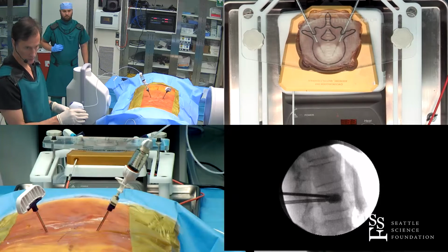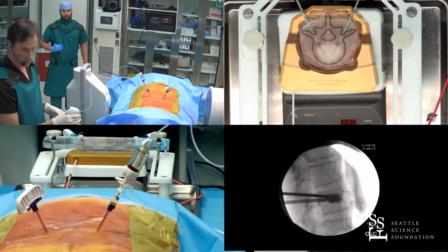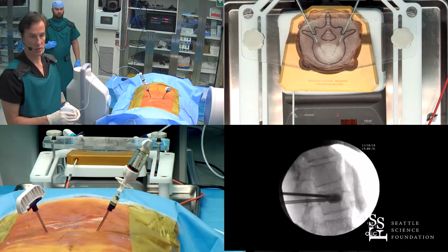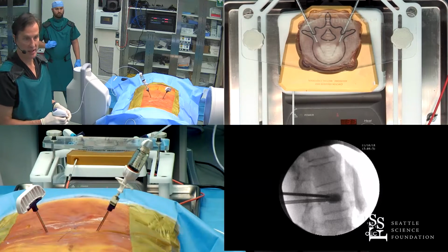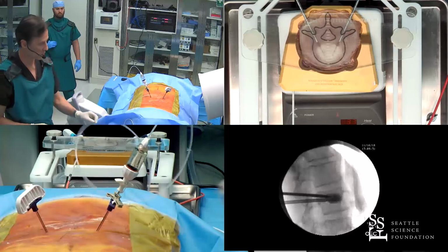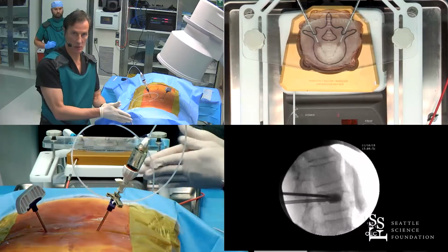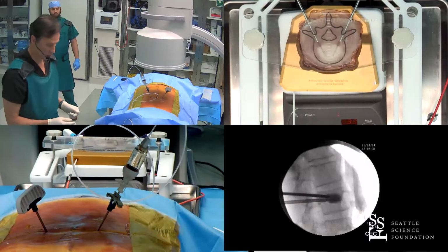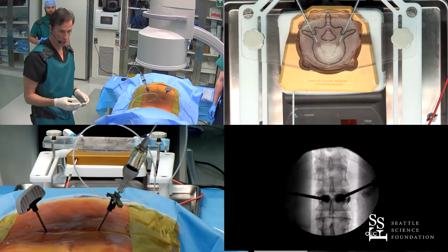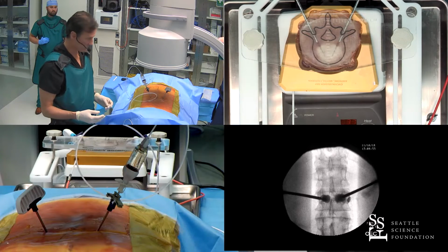And how much are you looking to put in? So commonly I'll put in about 5 to 8 cc's in a lumbar vertebral body. One of the errors that people make the most is not putting enough cement in. And this is a swing back AP. It looks very nice on lateral view. We'll take an AP shot. So on an average, at least 4 to 6 cc's per lumbar vertebral body, 3 to 5 cc's for a thoracic vertebral body. And these are just generalizations. These are just general rules. Very nice. Got a little bit of extravasation out the opposite side, but that is perfectly fine.